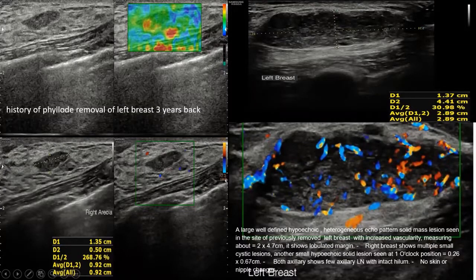If you look here, this is soft: the red is soft, then the yellow after the red, then the green, and hard is blue. The softest is red, less soft is yellow, and hard is blue, with the green in between, but toward the stiff part of the lesions.